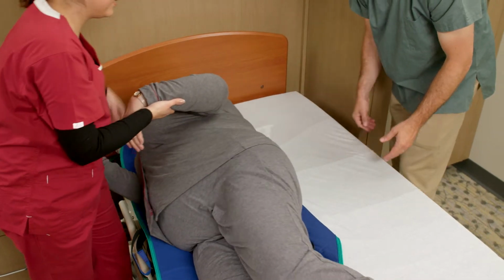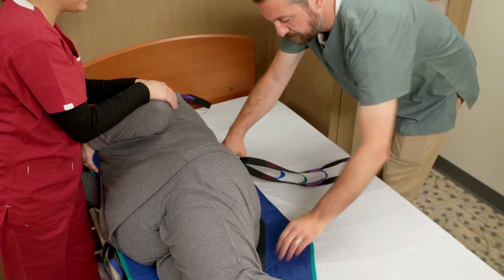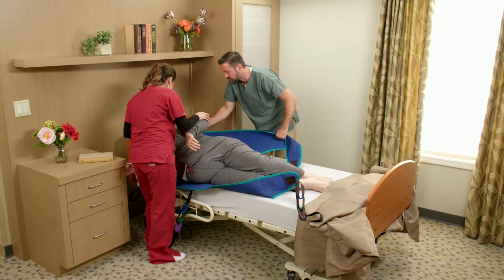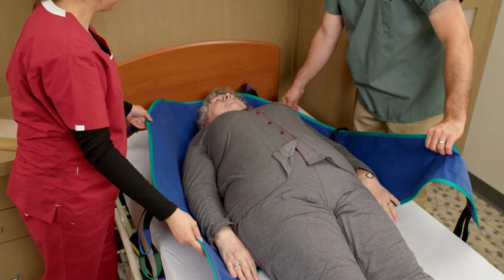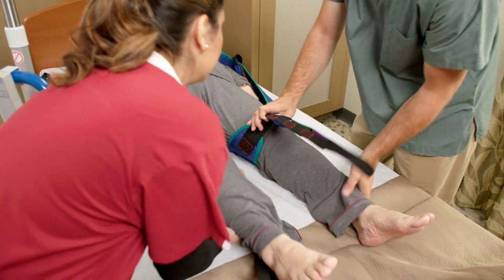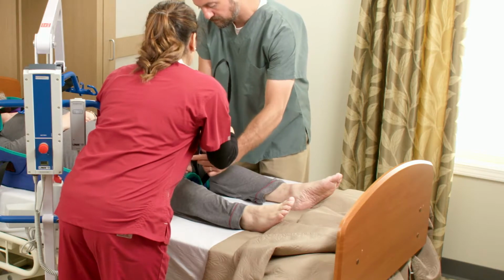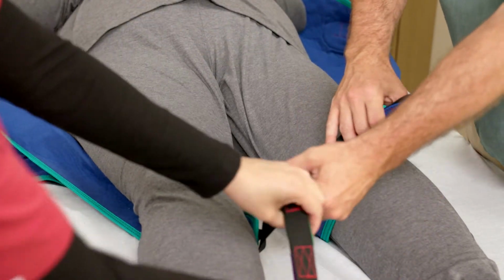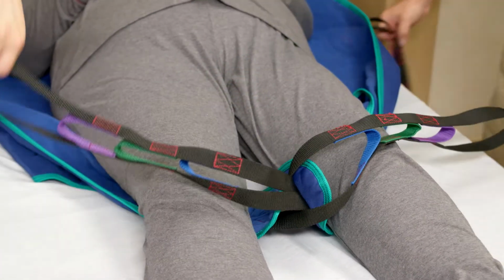After the resident has returned to lying on his or her back, instruct the resident to roll onto his or her other side, now facing the other assistant. Help as necessary. Flatten the folded portion of the sling on the bed. Encourage the resident to return to lying on his or her back. Help as necessary. When using a divided leg sling, slide the divided leg straps under each leg, making sure to smooth out any wrinkles or folds of the straps as much as possible to avoid discomfort or injury to the resident. With the straps positioned at approximately mid-inner thigh, be sure to thread one strap through the other at the bottom most available hole. You are now ready to begin attaching the sling to the lift.